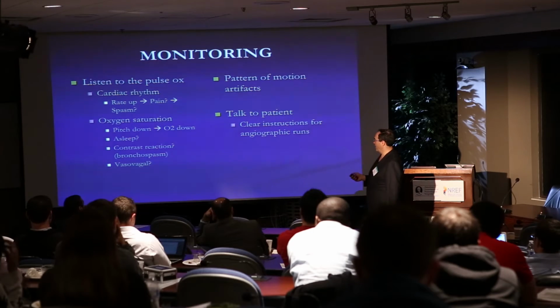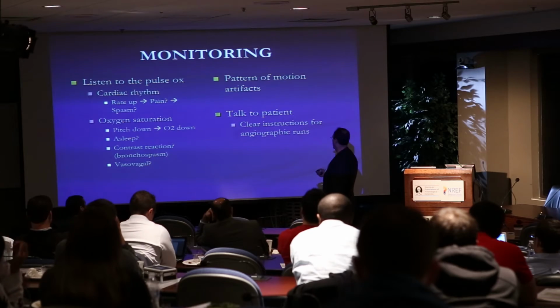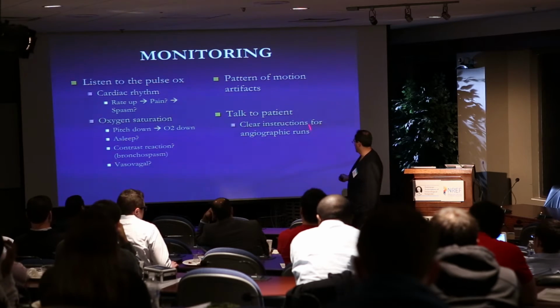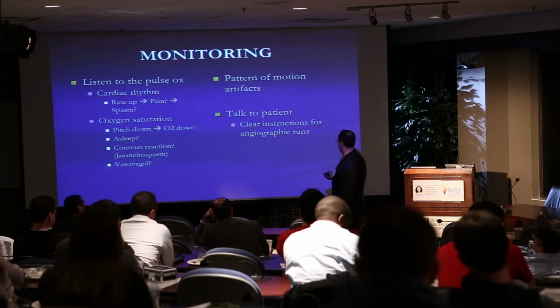But so I like to hear the cardiac monitor, but when you're doing conscious sedation, it's particularly important for you to be watching the same things that the nurses are watching. And most angio suites now have the big screens with all the vitals on it. And talk to the patients. That's why I don't like them too deep. I keep them comfortable. They're not really complaining. They don't remember any of the procedure, but they can either hold their breath for a rotational angio image, or they can at least hold still when you're trying to open up something and get a better image of something that you're interested in.